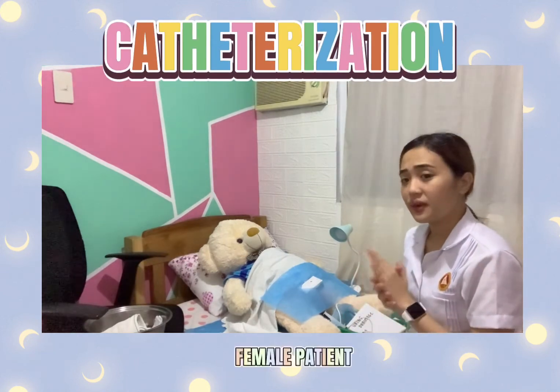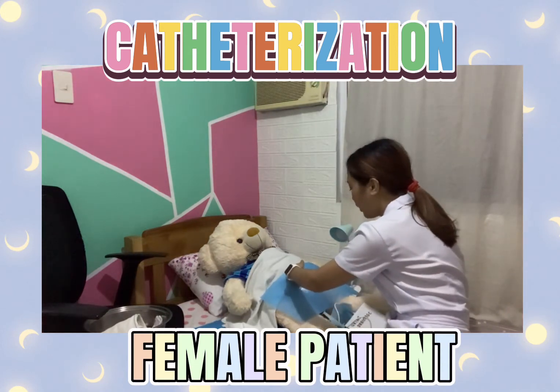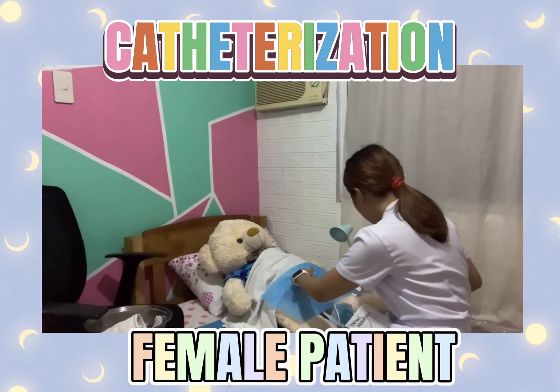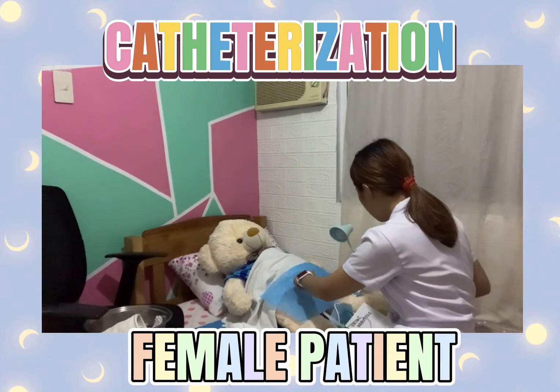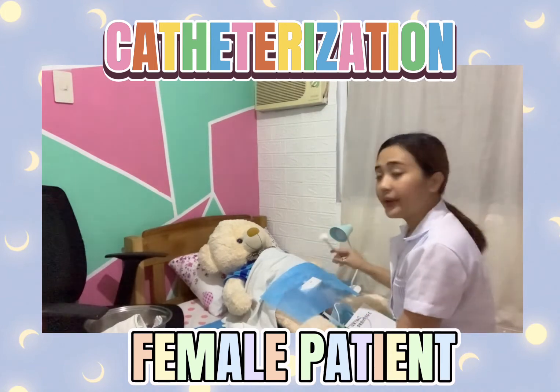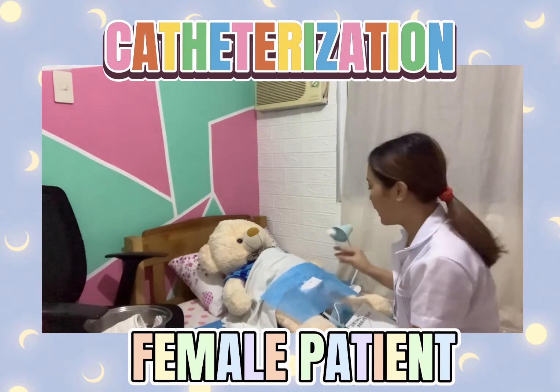For the female patient, we need to separate the labia minora and majora to find the meatus. Here, we will use the cotton balls to clean the labia minora and majora of the patient, as well as the fold.